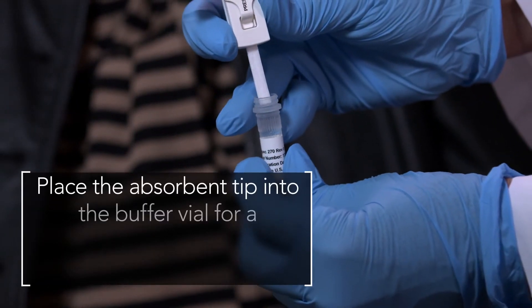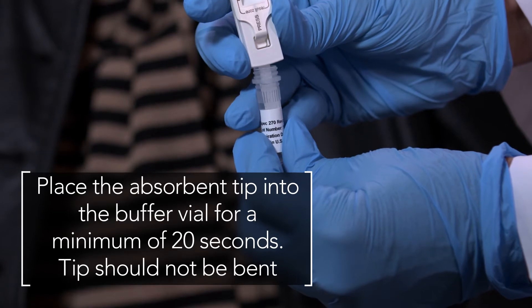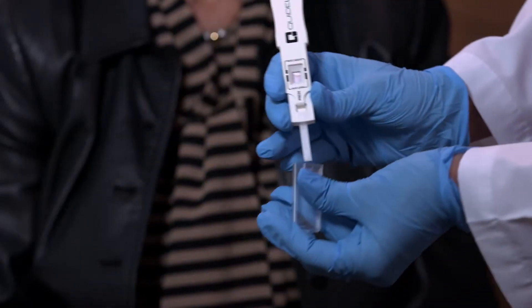Place the absorbent tip into the buffer vial for a minimum of 20 seconds, ensuring that the tip is not bent. Once the test has been activated, remove it from the vial and replace the protective cap.